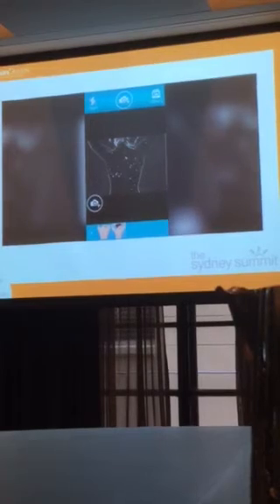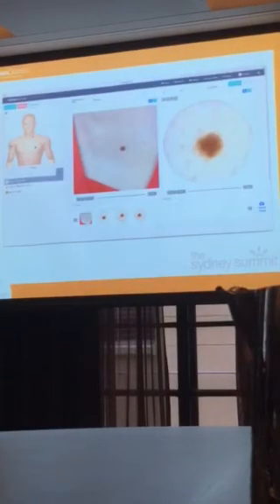So I think we're moving off into areas that we're not going to use. I use only a portion of that. I use it very simply. I use it for some element of full body photography, but I actually do very few body parts, usually a back on most patients, simply because they can't watch it for themselves, and individual lesion photographs. And that's really the most I use. I use very few of the advanced technical parts of it, but for that alone, it's well worth it.